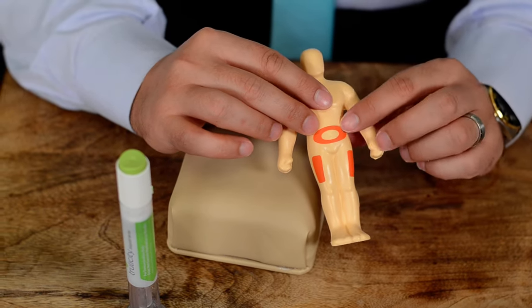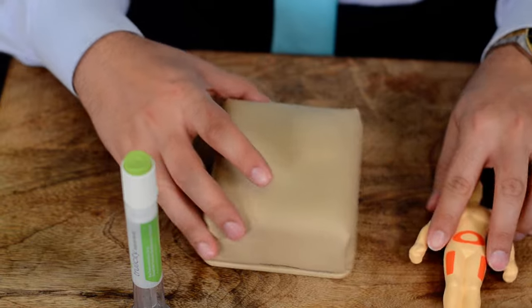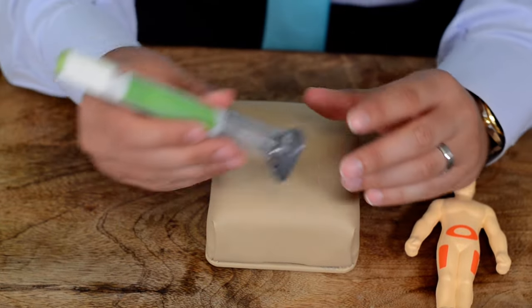Most people prefer the thigh or the abdomen. Now we will consider this is your abdomen, and this is our Trulicity pen.